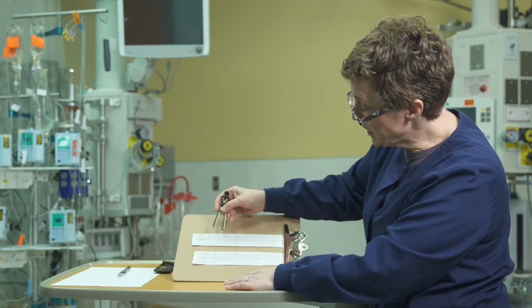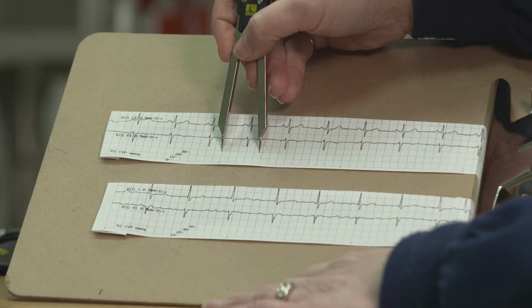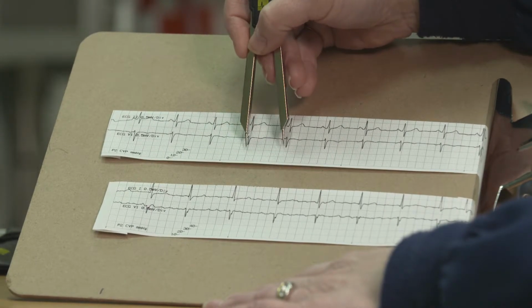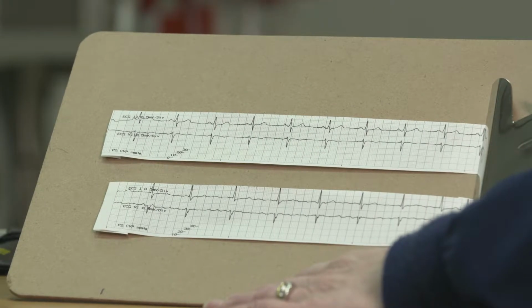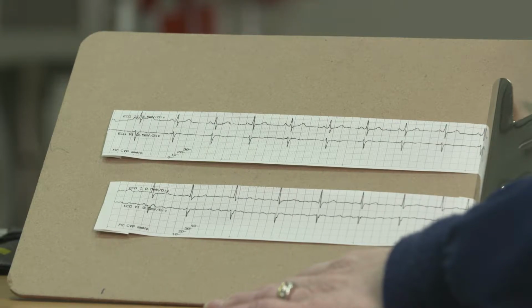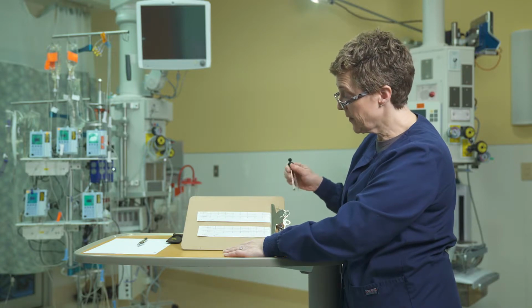The other way to do it is you can use reference lines. So 300, 150, 100, sorry, and I've moved that off. But you have to find your way. You've been given a number of ways in your textbooks that help you determine rate, and you use the way that works best for you.